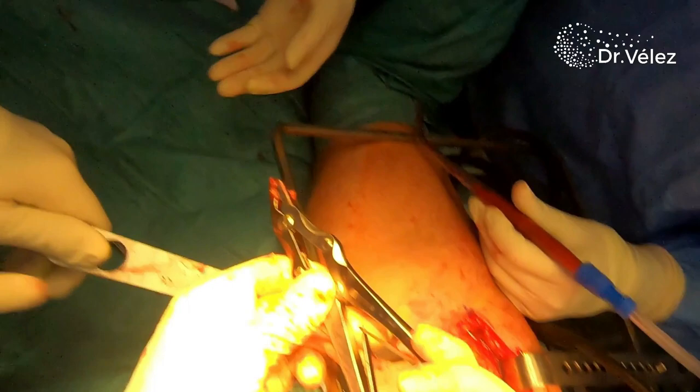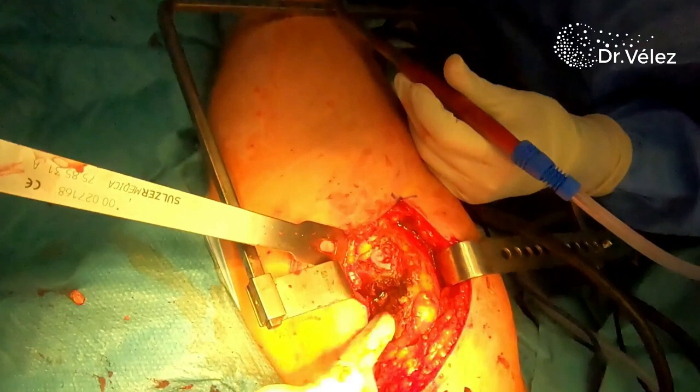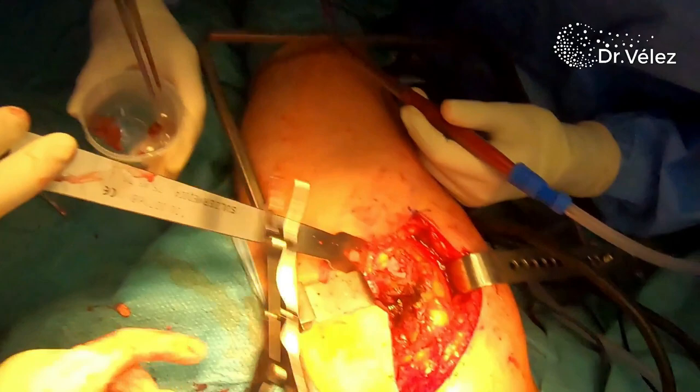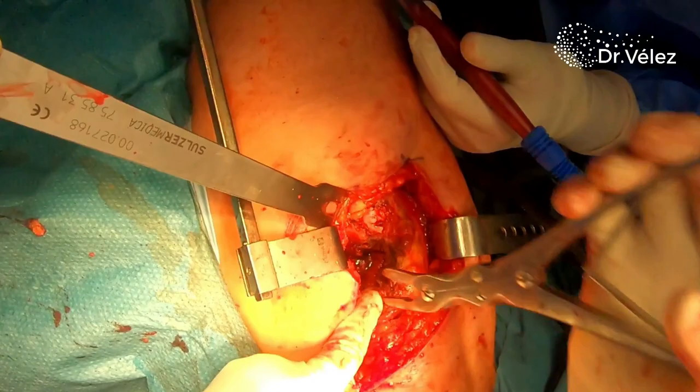We also take some time at this moment to remove any metastatic tissue that we see evident and that could compromise the stability of the hip prosthesis. We also send these fragments, which are removed with the Rönger, for analysis in the pathology lab.